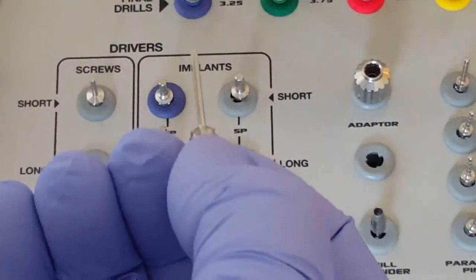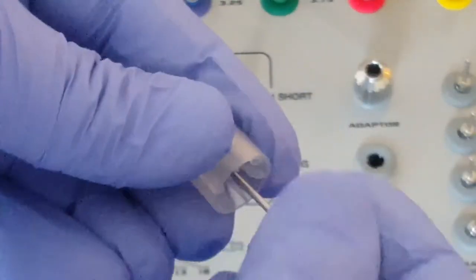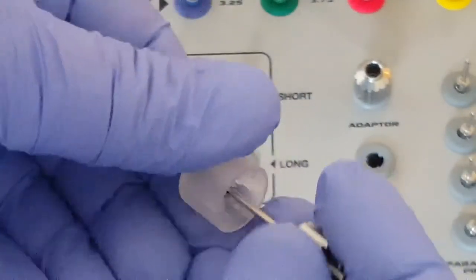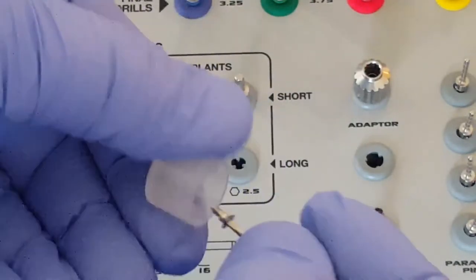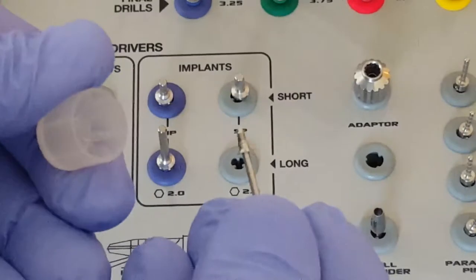That screwdriver then can be utilized to remove the cover screw from inside the cap. And that cover screw can now be inserted into the implant.